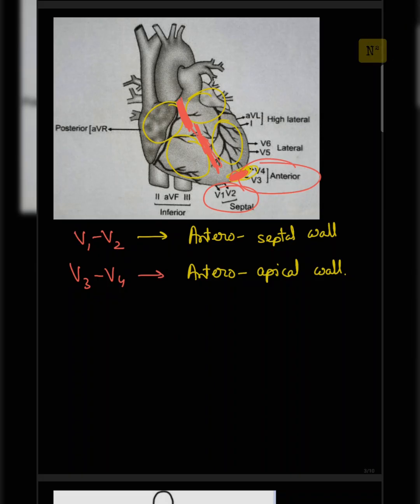If you are getting an abnormality in lead 1, and sometimes lead 5 and lead 6 of the chest leads, as well as the left arm lead, that is showing you lead 1, which connects the right arm with the left arm, as well as the augmented AVL, on the left part of the body, as well as the leads attached at the mid and anterior axillary fold.